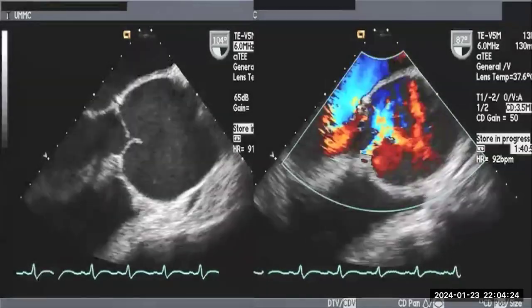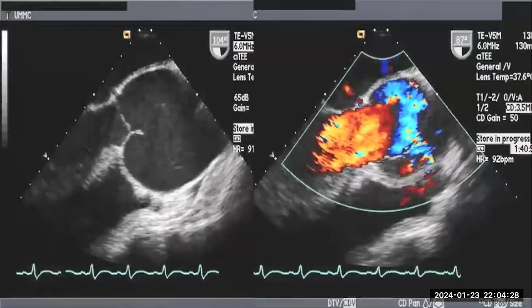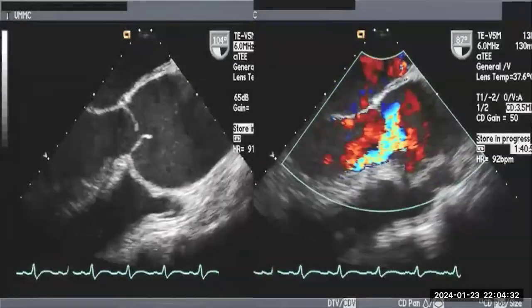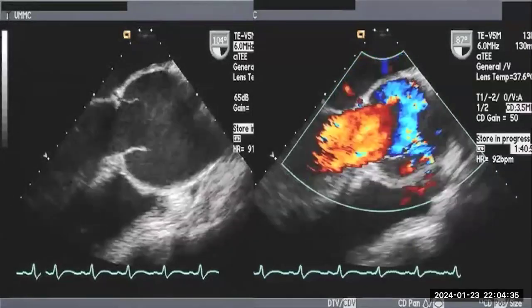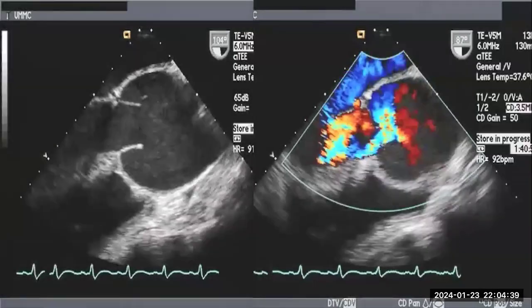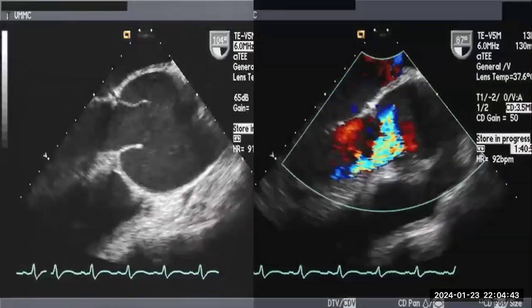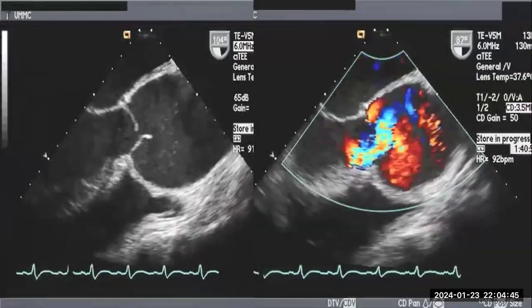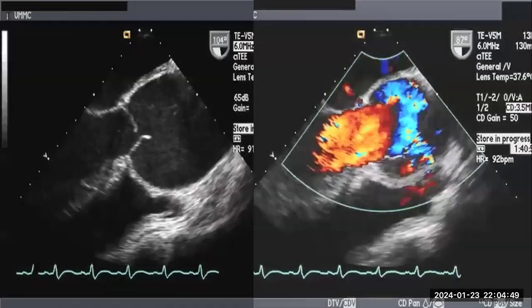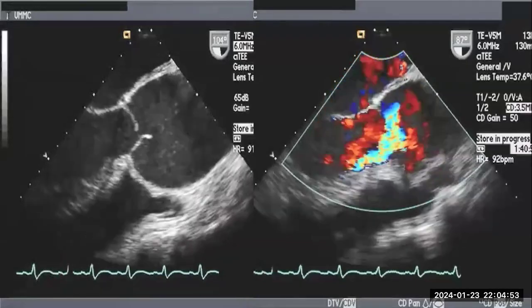Easy one. Come on. I can take it. Yes, go ahead. Anwar, a very huge aortic root. Okay, excellent. Very huge aortic root. So we have to see the different views also to look for any dissection, mitral prolapse. What do you see also? Comment, and you have mentioned that there is a huge aortic root. What do you have also? What do you think about the aortic valve itself?